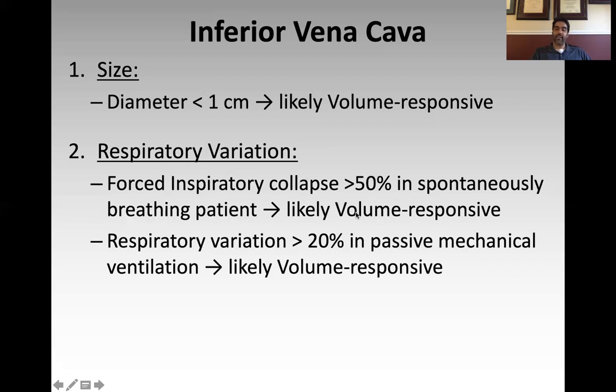What this is getting at is that their right atrial pressure is low. So if you have a low right atrial pressure, say what you want about CVP, but if your CVP is low and you're in shock, give fluid.